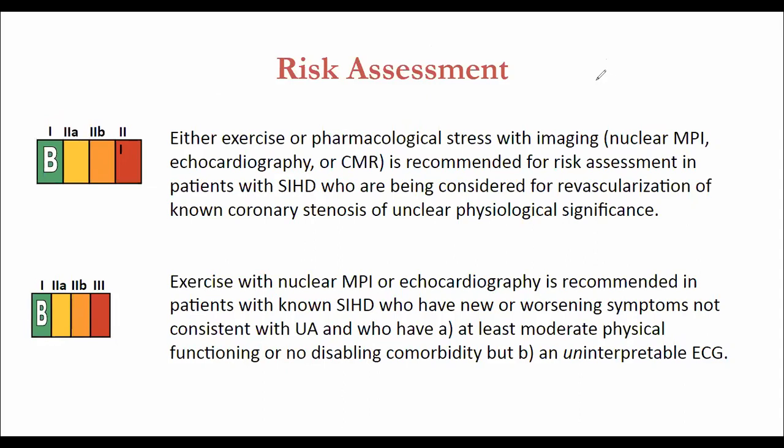How to tell if the LV dilation we had discussed is more than 25% from the baseline? From the rest and stress images, then you will see it's LV dilation.